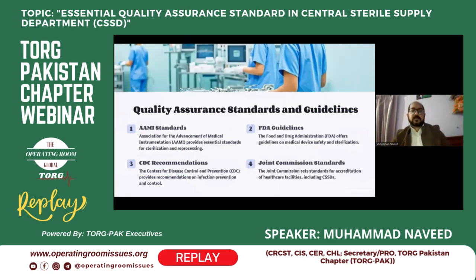There are quality assurance standards and guidelines we are using in our CSSD. First and most important is AAMI, the Association for the Advancement of Medical Instrumentation, which provides the essential standards for sterilization and reprocessing. That is a main pillar of the CSSD when we build any SOPs and KPIs. So we have to follow the AAMI standards.